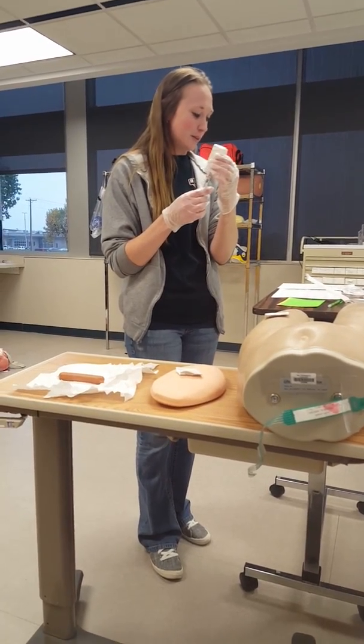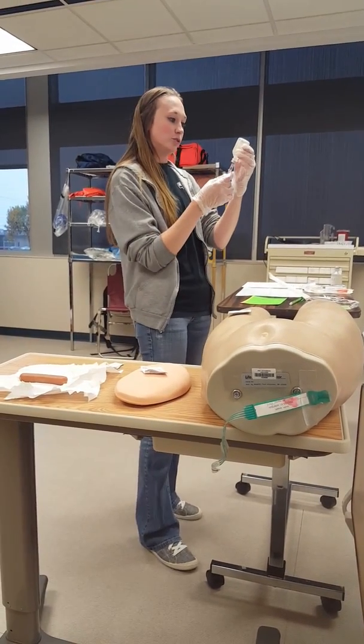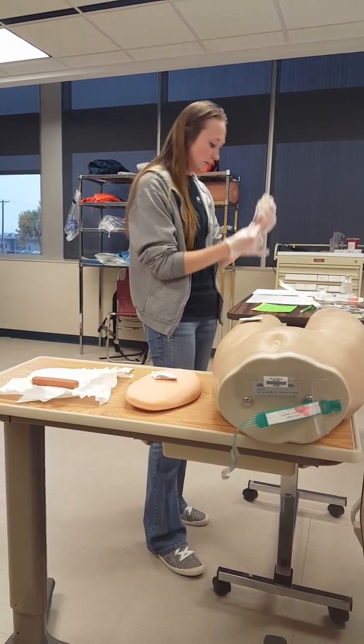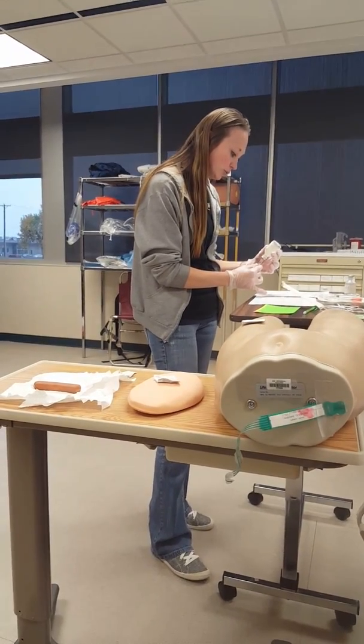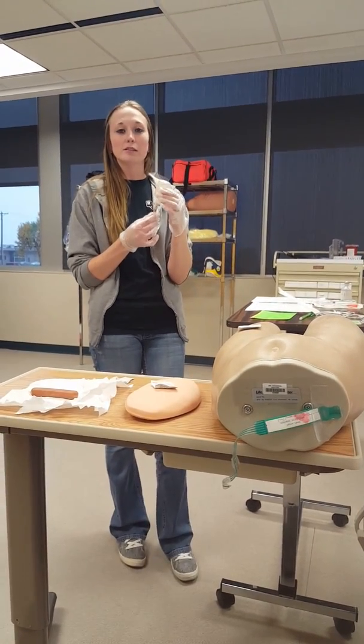Okay, and then I'm going to do my third check. So tuberculin 0.1 mLs, 0.1 mLs, and then I check it to my MAR, tuberculin 0.1 mLs. And I'm going to say my 5 rights.